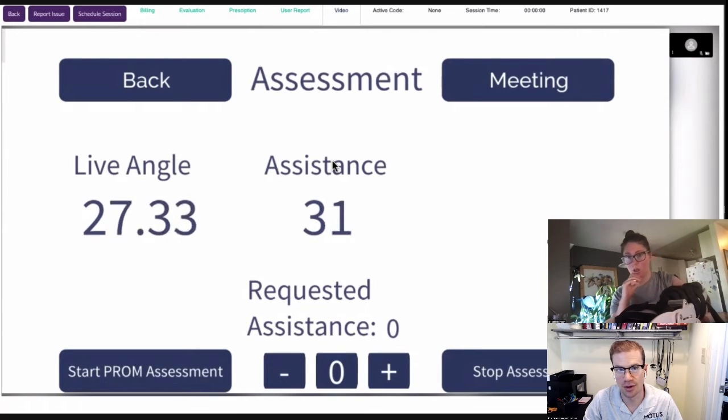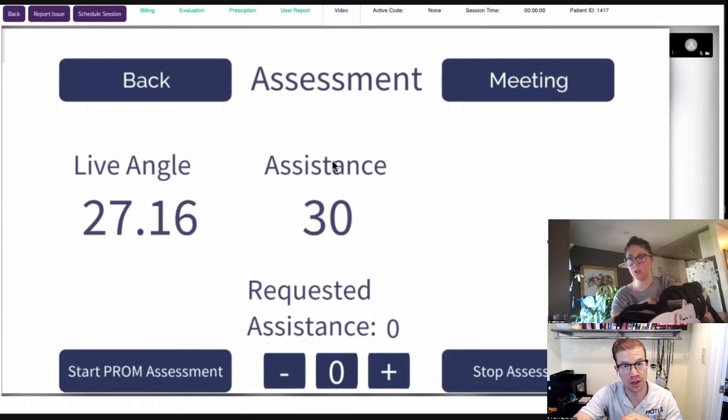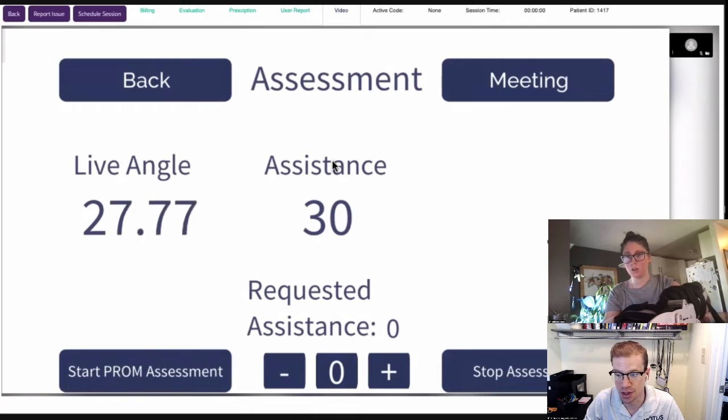There you go, good. So this is the process that has to happen, right? You have to get that feedback. You have to drive the neurons, but while you're doing the right thing. Whenever you're intending to move up, you have to make sure that you're mapping that onto the correct visual stimulus with whatever you're intending. I think this is quite helpful, because this way you're understanding that you can move in both directions.